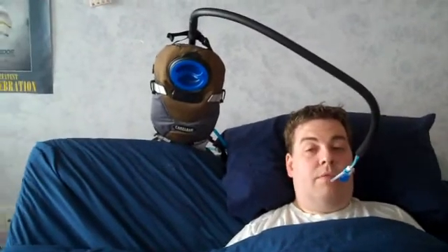I'm going to do that now — lower the bed. As you can see, the sip-and-puff switch provides direct control of the bed position.